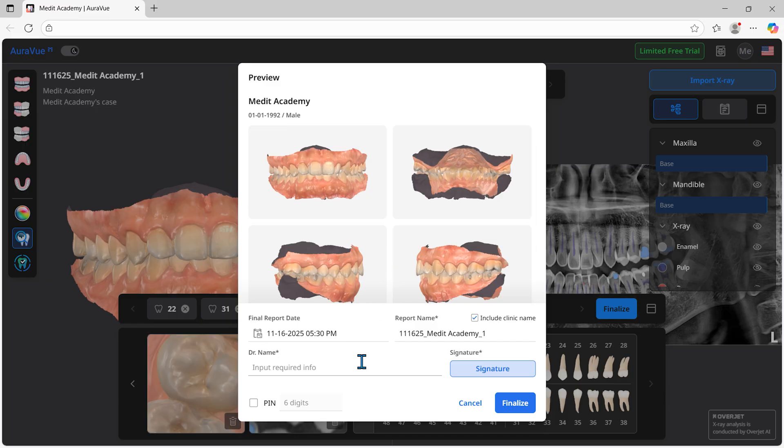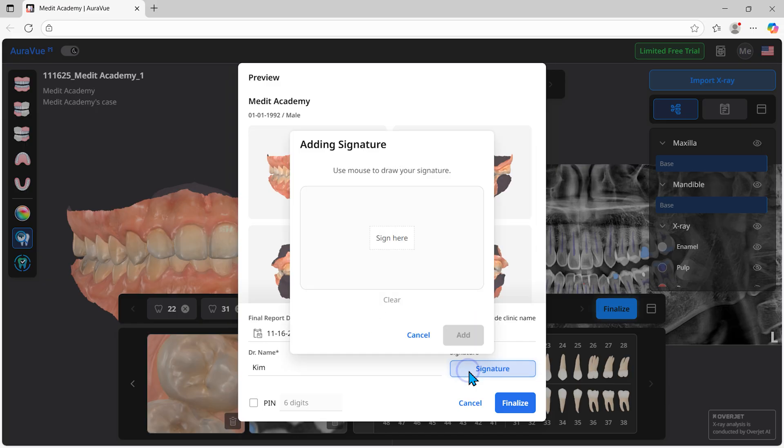After configuring the final settings for the report, simply enter the clinician's name and signature.